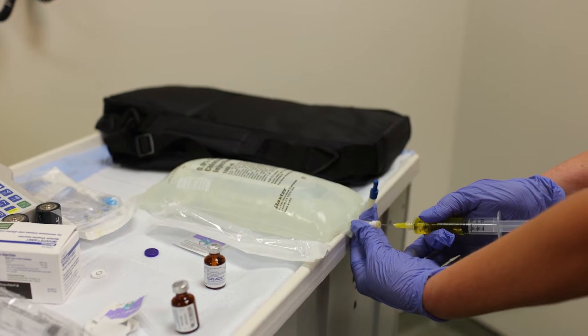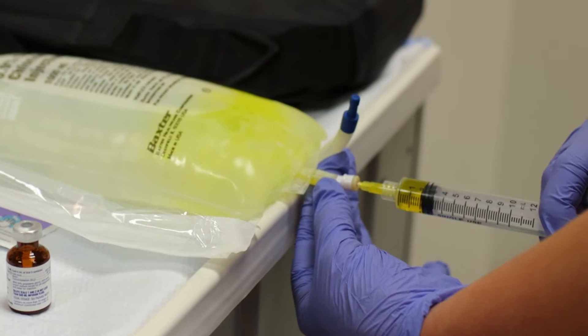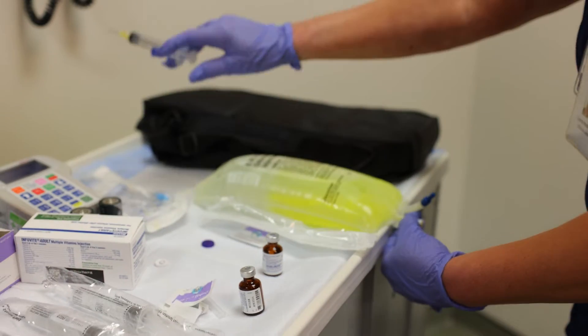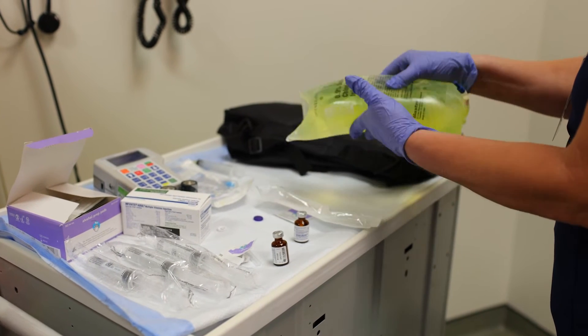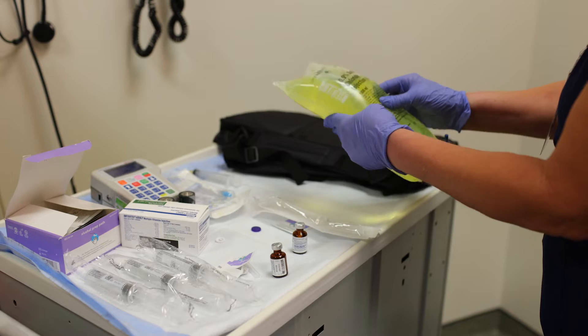Take the air out — we've already cleaned this — hold it like this and inject right in the middle. We're going to inject the vitamins into the TPN. Then put the syringe in the sharps container and gently, evenly distribute the vitamins throughout the bag.